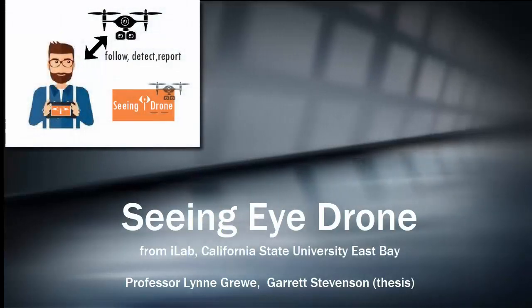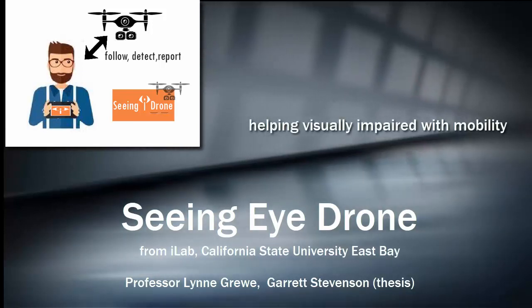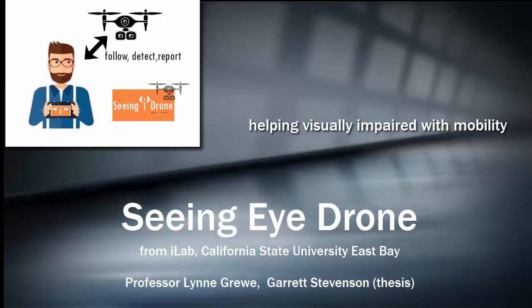Seeing Eye Drone, a system to help the visually impaired with mobility.